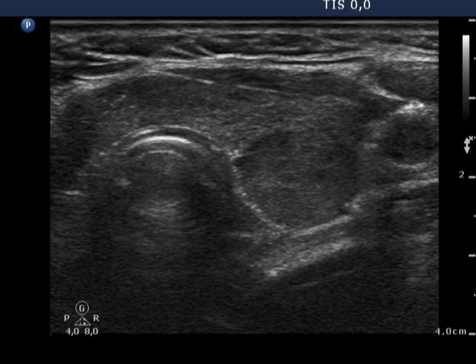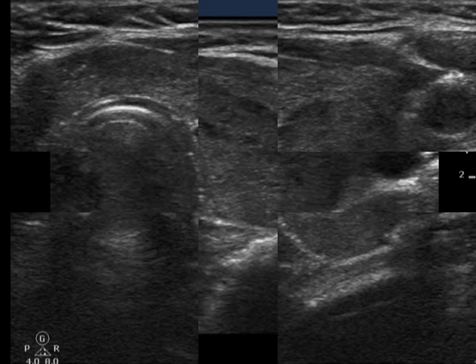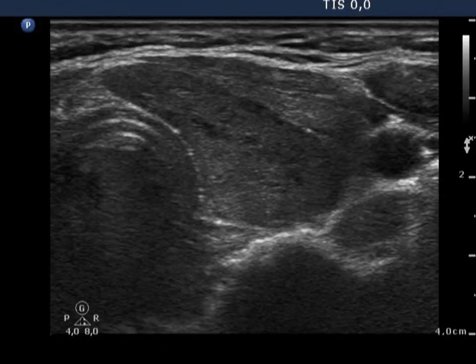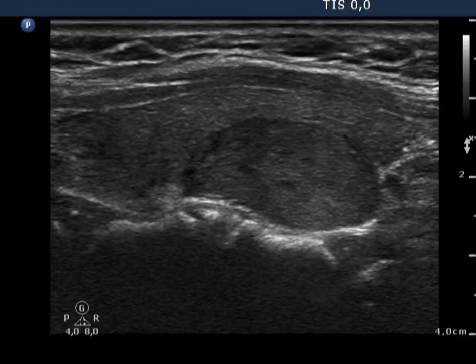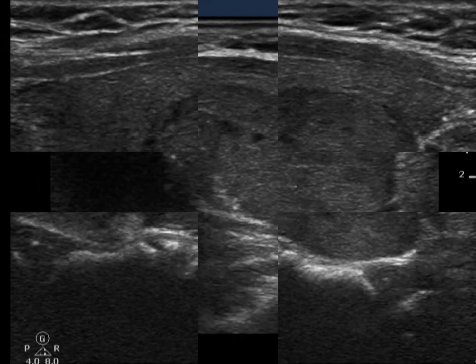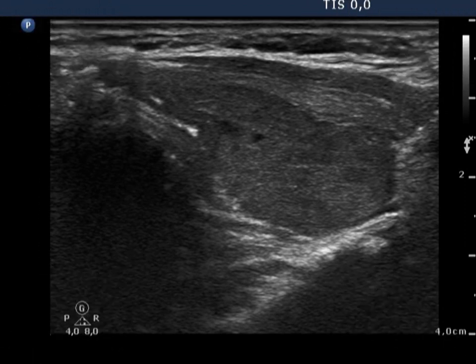There is a hypoechoic lesion, seemingly a nodule in the left lobe. If we analyze the longitudinal section, it is clear that the lesion is pipe-like and runs along the dorsal part of the lobe — it cannot be a nodule.